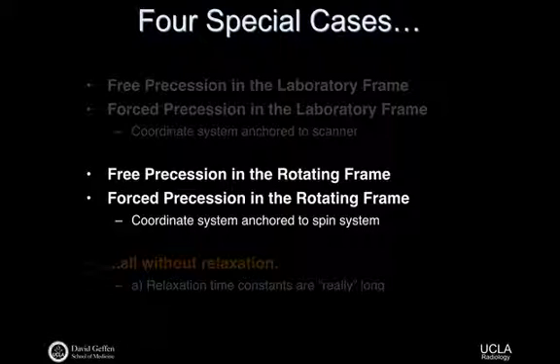So we're going to start with the same conditions that we normally start with. We know that our applied B field is just the B0 magnitude along the K direction. And between these two coordinate systems the K direction is shared, so that's equivalent to B0 in the K hat prime direction.